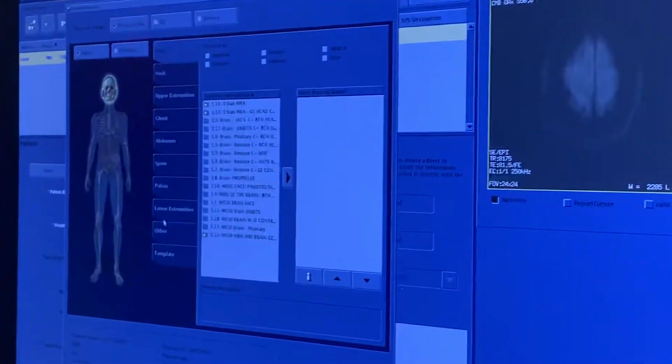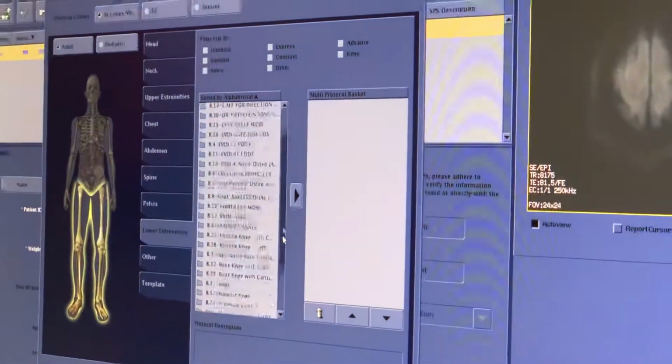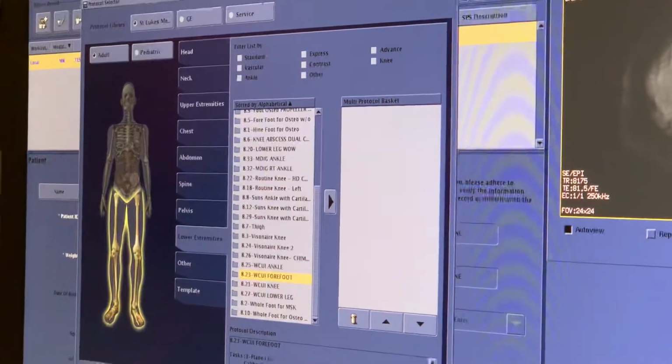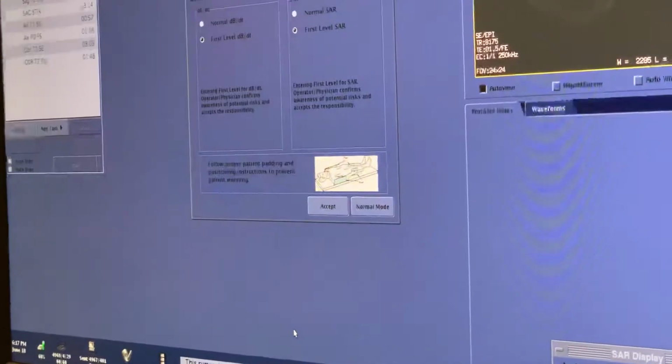is located in the lower extremities. So you click on lower extremities. Now we have this Forefoot protocol. Again, the one at Tempe might be a little different, but the slice positions are the same, ish.